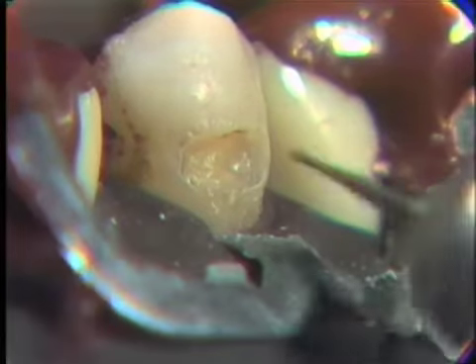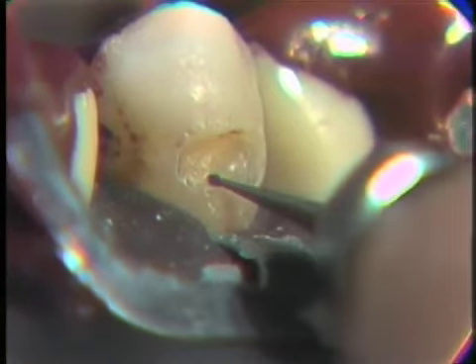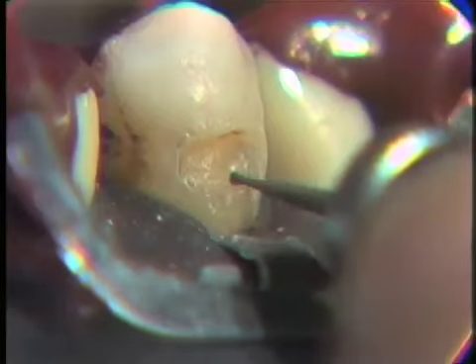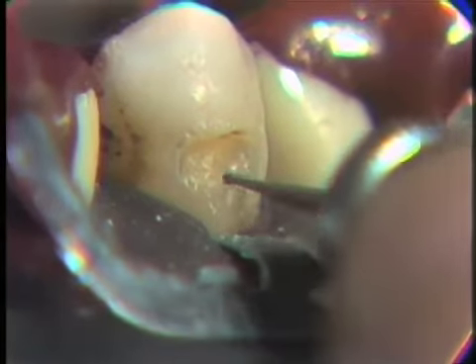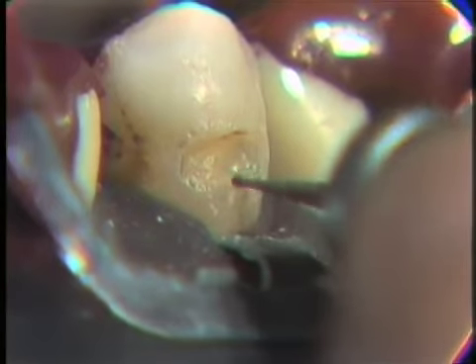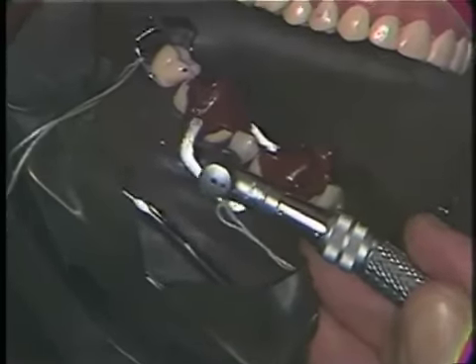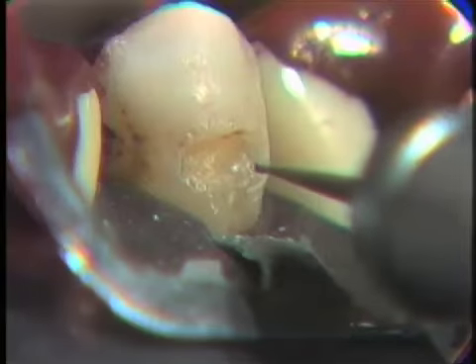Now, to dry run this a little bit, one could apply the burr against the tooth, touch the axial wall, feel the axial wall, and then run along that cervical wall in this fashion. With good control, you should be able to cut in laterally and not in axially. The same thing applies to the occlusal wall. Put the burr against the occlusal wall, run the burr back and forth from mesial to distal. Now, this effect will give you some guidance in the placement of this retention.